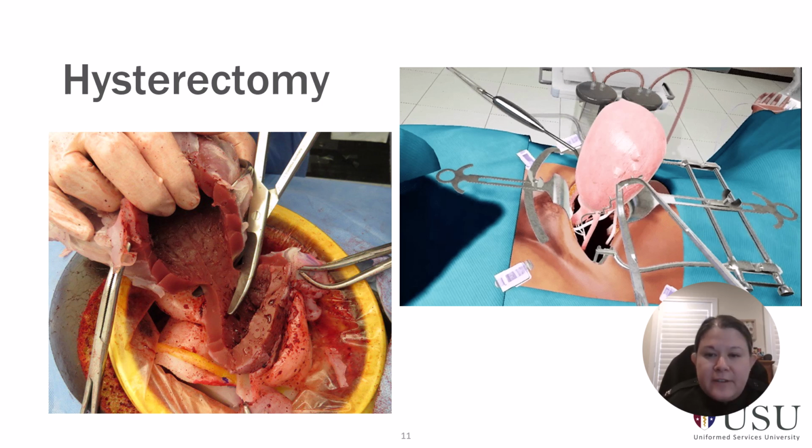So for hysterectomy, there are definitely some models that are available. The one on the left here is the operative experience model. This allows for an in situ simulation experience if you wanted to do this in an operating room and test your processes and procedures for an abdominal hysterectomy or cesarean hysterectomy. That's a great model. You can see much of the model is made out of silicone. So the nice thing is sometimes you can actually re-silicone back or glue some of the components back together and reuse them. So that can be a little more cost effective.